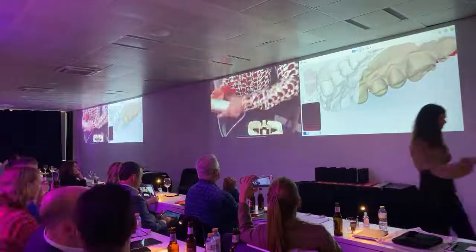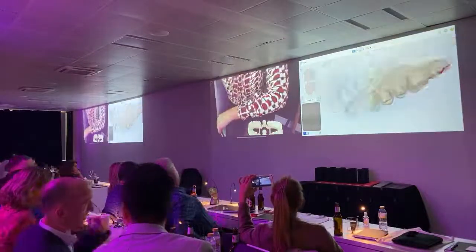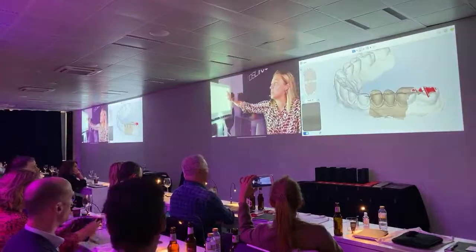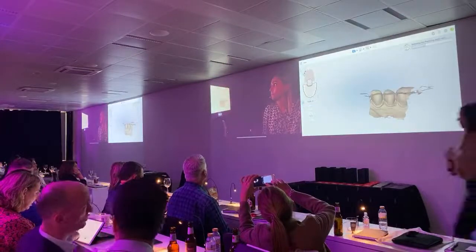And then you do this in all the preps. I will not do it in all, but I want to show you in the post-process another thing that you need to do. Imagine that I did this with every prep, and then you go to post-process. You wait.